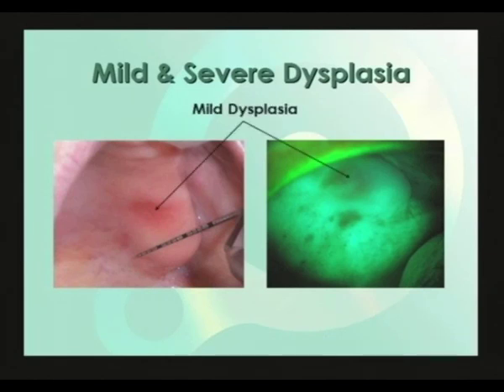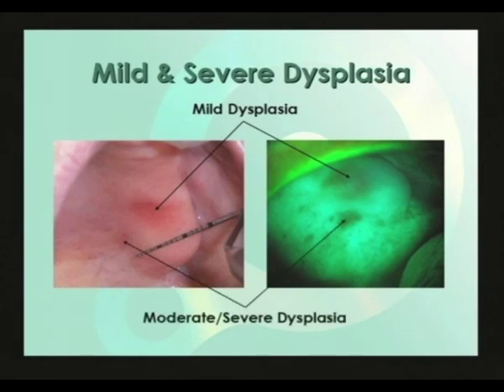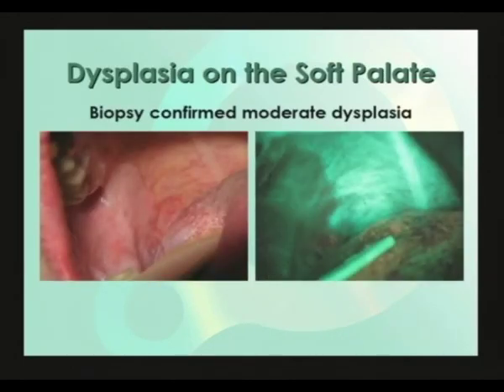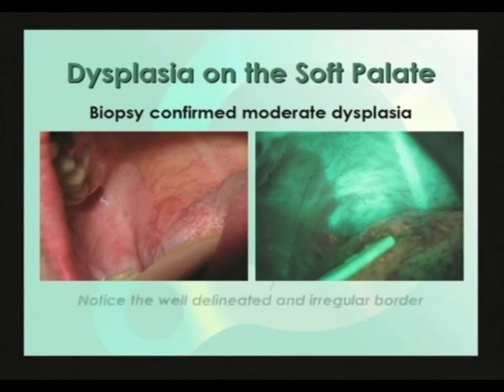Our first example of dysplasia is an interesting one where the larger, more obvious area in white light was confirmed by biopsy to be mild dysplasia. The smaller, less obvious area under white light, which looks darker with more well-delineated borders under VELscope, was found by biopsy to be moderate to severe dysplasia. This is an example of a large area of leukoplakia on the soft palate confirmed by biopsy to be moderate dysplasia. Under VELscope, the leukoplakia presents as a dark area in stark contrast to adjacent healthy tissue, with a well-delineated and irregular border.